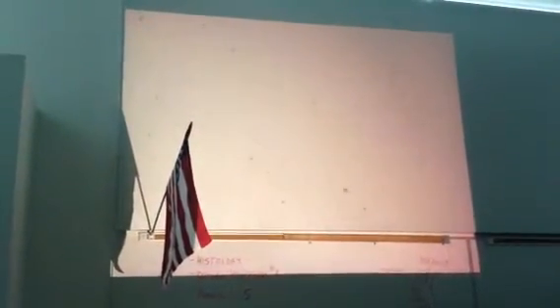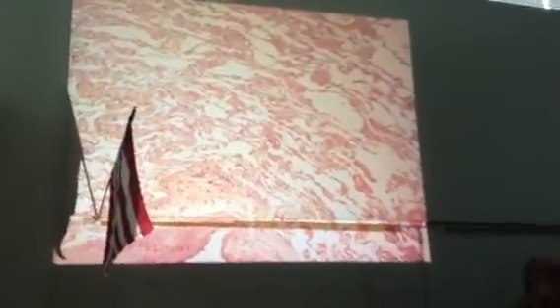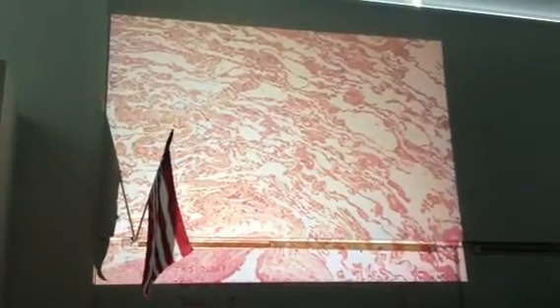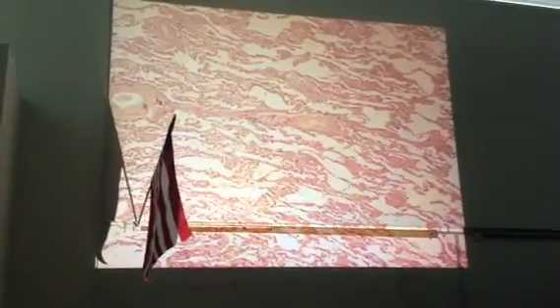It's not very satisfying to look at this because everything looks like it's just crumpled, because there is no connective tissue in the wall of the alveoli. And all of these things that look like spaghetti here, they were the air sacs. So like, here was an air sac right here, and there's one on the other side, and there's one right here. We have 350 million of these in our lungs, and they sit sometimes this way, with the one next to it going that way, or sometimes like this. And I'll show pictures when we do lecture on this. But these represent the crumpled alveoli, and we're going to look for a bronchiole.